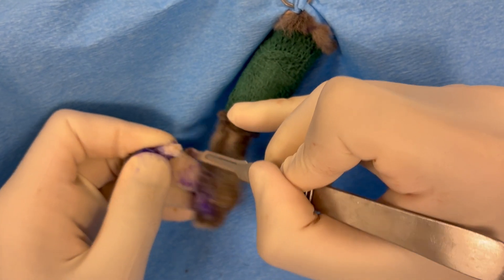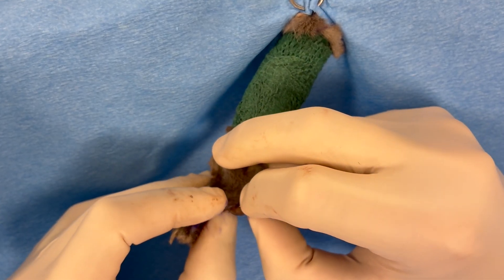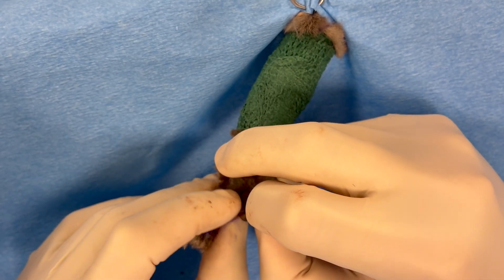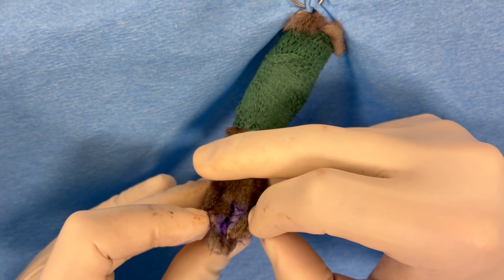After the amputation has been performed, we're going to assess what the local skin looks like and determine the best way to oppose or close the incision.